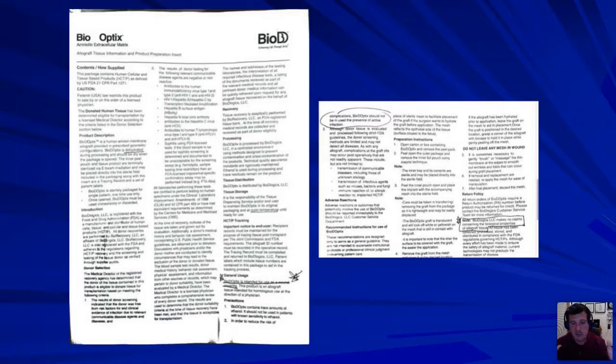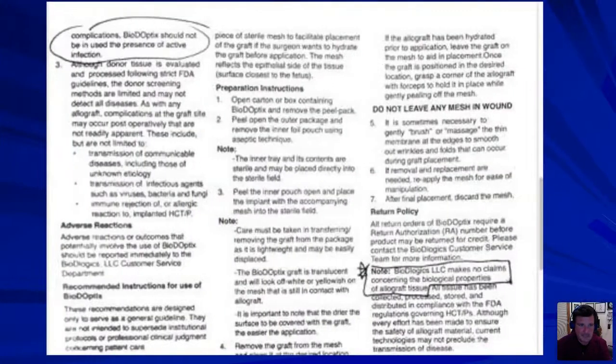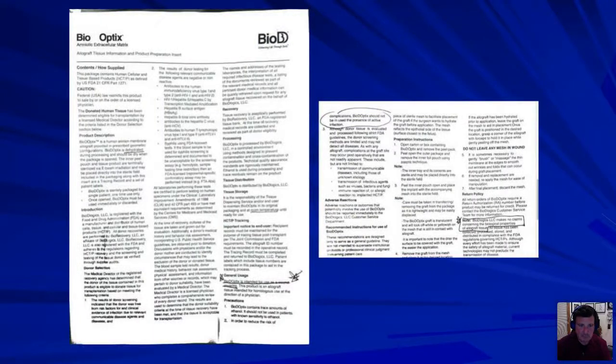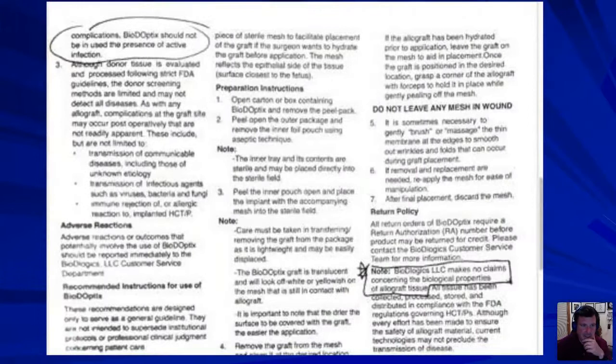So all you have to do is go to the next trade show, hopefully when COVID-19 is all over and we can go back to doing live presentations and have an exhibit hall. If there's someone exhibiting, just go and take out the package insert. And this is the package insert that's inside. I have a few things circled, and right here is what I want to point out.